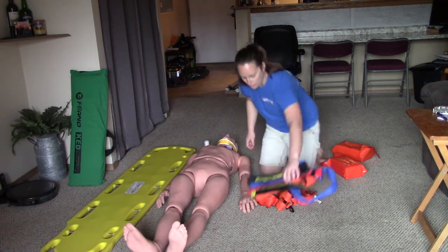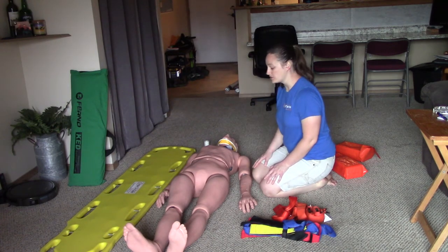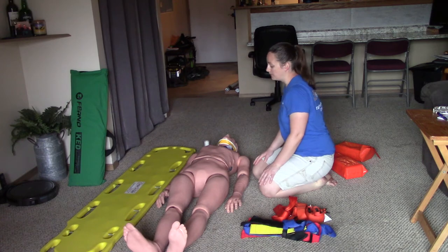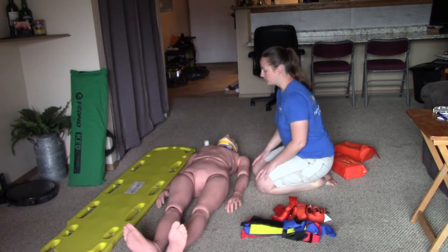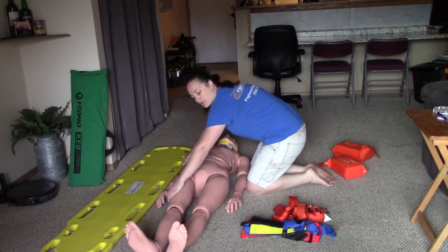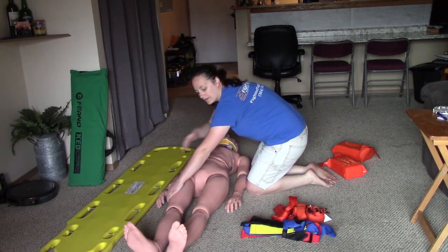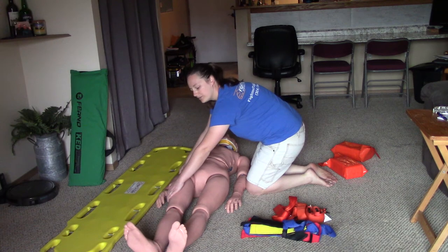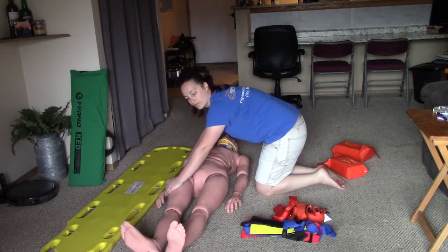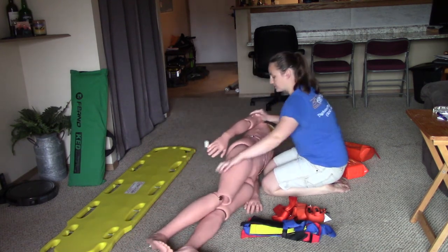We now have our cervical collar on and are ready to log roll our patient. This is really a three-person task — one person holding c-spine and technically two people doing the log roll. To properly log roll, one rescuer has one arm on the shoulder and one on the femur; another rescuer next to them has one arm on the pelvis and one on the lower leg, with arms crossed in the middle so everyone moves as one unit. The person holding c-spine does the count: 'We're going to log roll on three — anyone not ready? One, two, three' — and everyone log rolls together keeping the patient's spine as straight as possible.